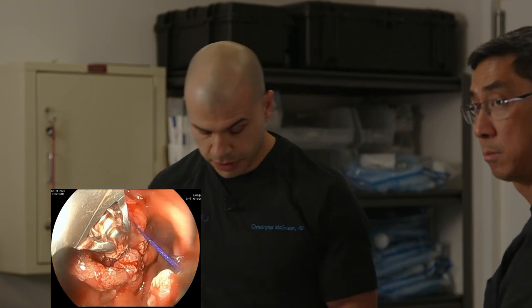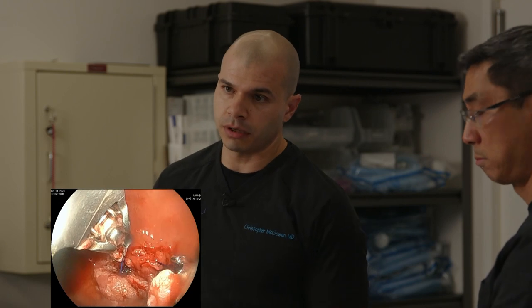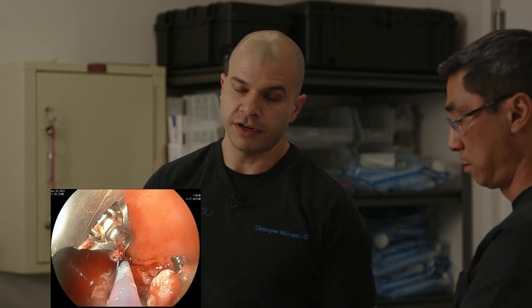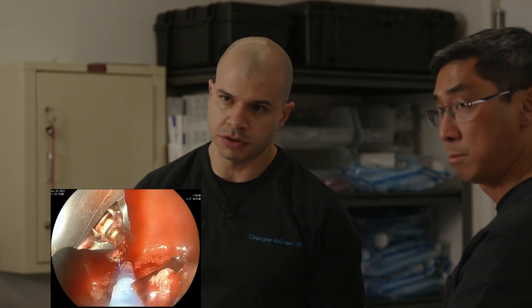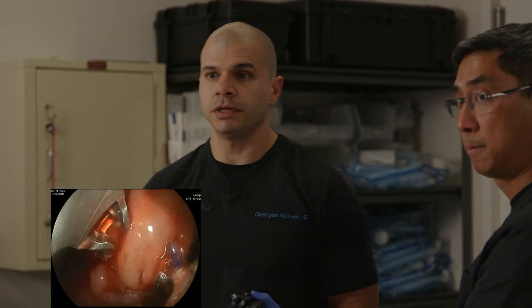Things can happen. You see some bleeding here, but there could be bleeding, there could be infection, you know, things can happen. We are suturing, but the rate is well less than 1%. In fact, in our program, we've only had one patient here in 5 years who had a bleeding episode that was treated just a few hours after the procedure and resolved. That's all we've seen, but we tell every patient things can happen.